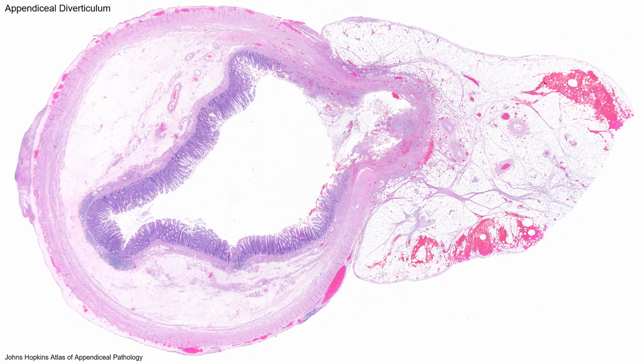And I can see that I'm losing some of my normal mucosa in that area, but given that the background mucosa all looks pretty normal away from the diverticulum, I'm comfortable saying that this is not a pushing border of a LAMN and is rather just a benign diverticulum. And again, of course, we'd want to submit the whole appendix to make sure that we don't see anything concerning.